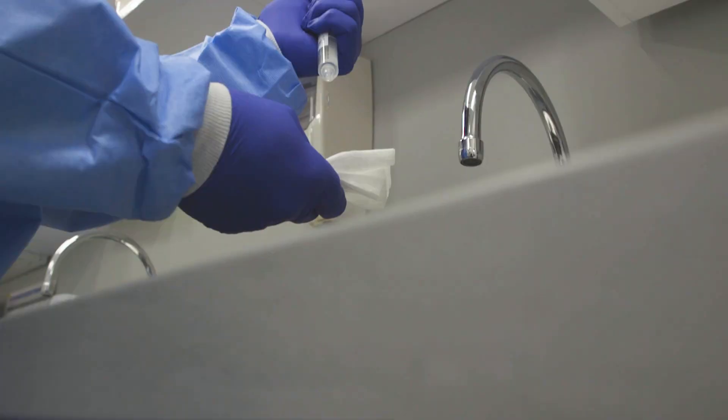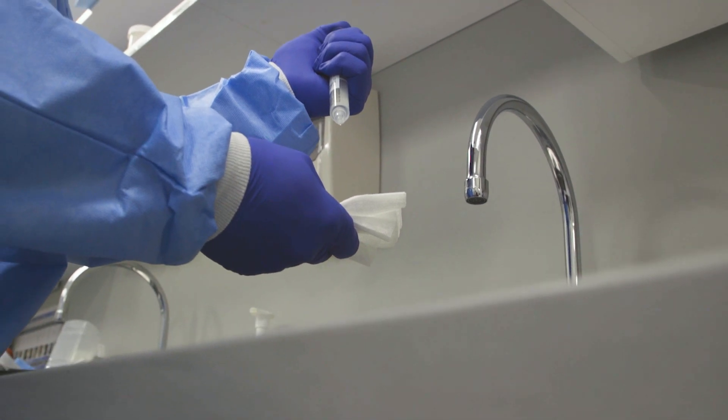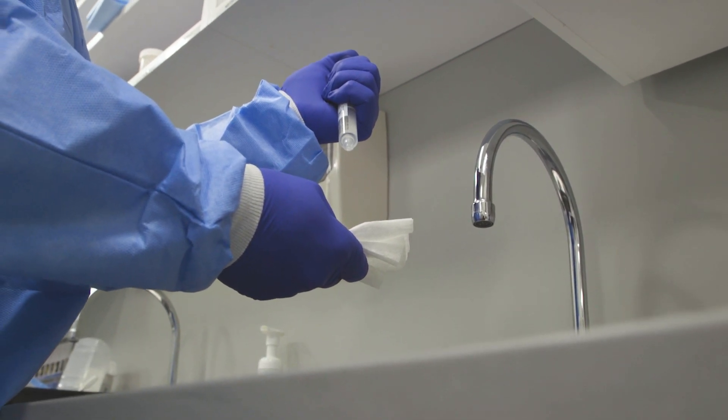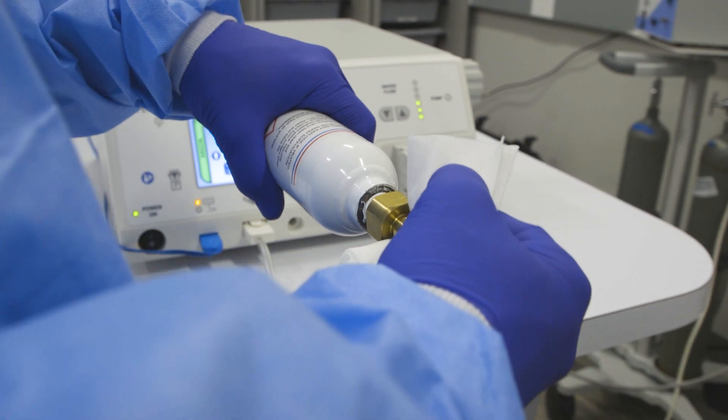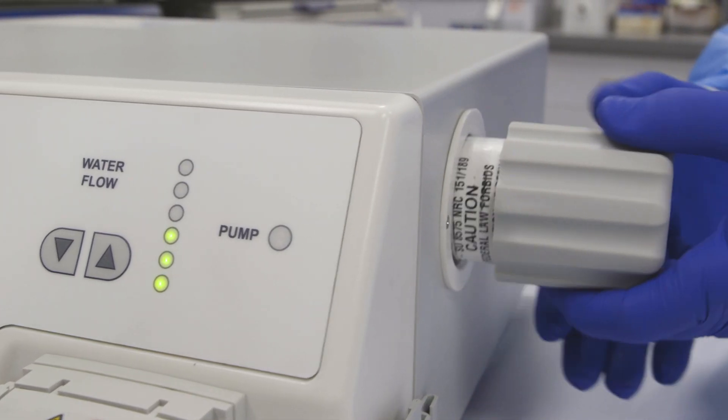If the threads are undamaged, while using gloved hands, pour a few drops of sterile water onto a clean, lint-free gauze and wipe around the brass threads, then reinstall the bottle.